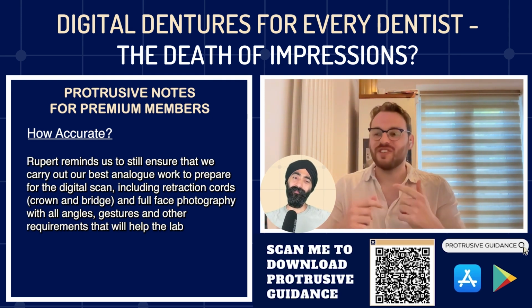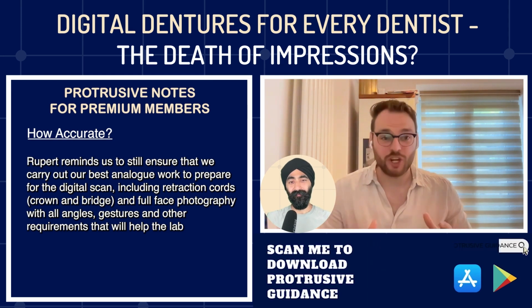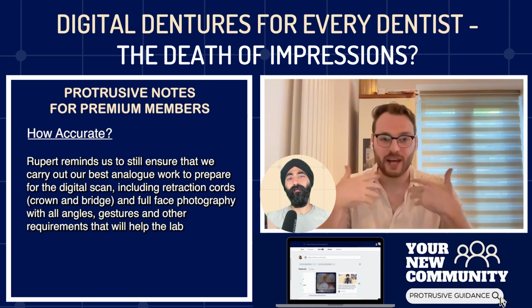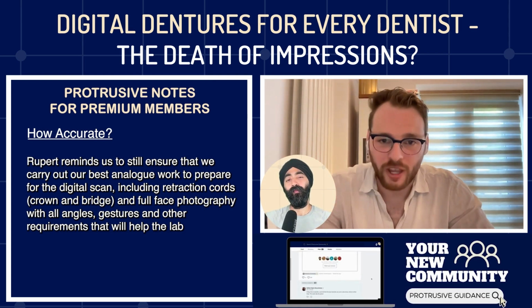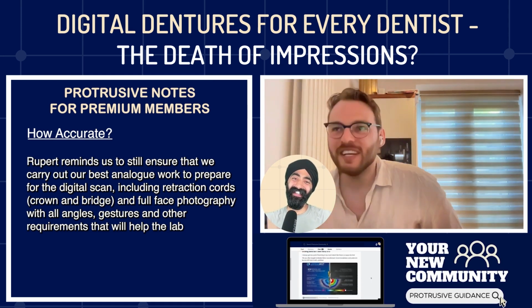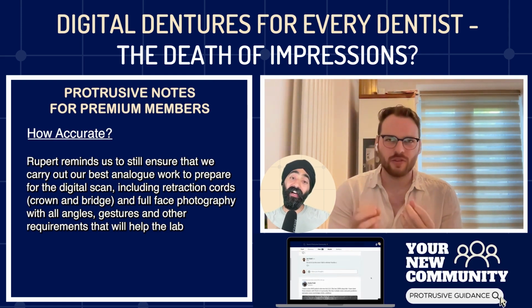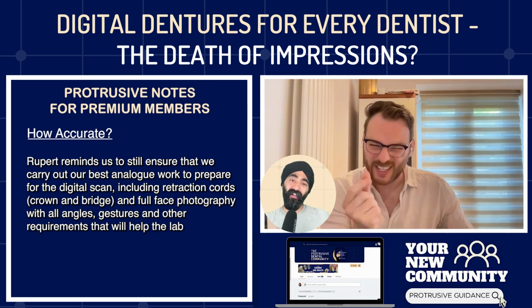Yeah. So you've still got to do all of that brilliant analog work, which includes, for me, and my workflow doesn't change when it's a wax try-in, taking full face portraits, full set, side on, relaxed, smiling, etc. So Dean can sit there as he normally does and say, "You got the midline wrong again." Yep, idiot. Yeah, I'm going to do that, tweak it across. So all of that, and he can still tweak all of those things. But you've got to think on your feet a little bit more compared to, just as you say, tweaking teeth a fraction.